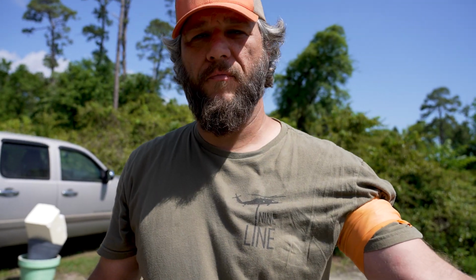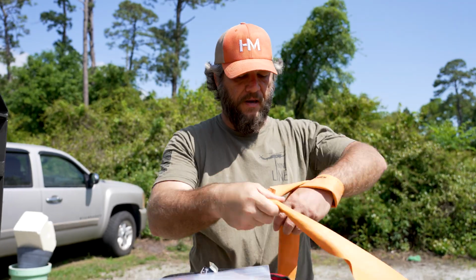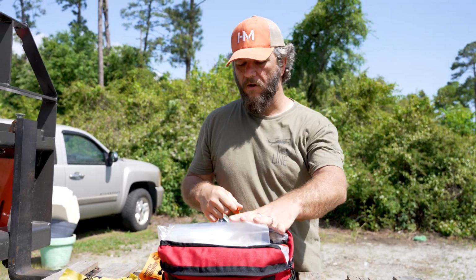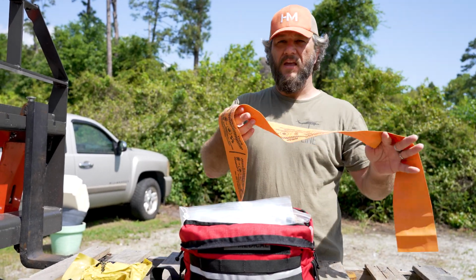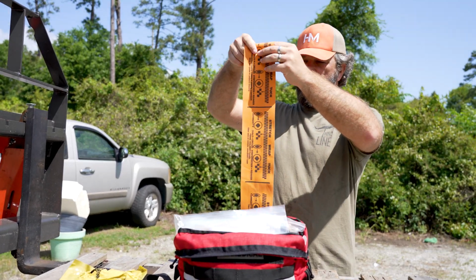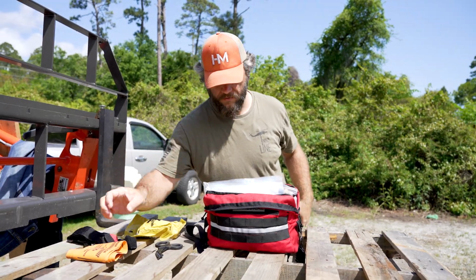Okay, so there is a way of doing that. And I have seen, on Bear Independent, the channel of the guy who owns Refuge Medical, one of the guys there was saying that he actually cuts these in half so that he has them for kids. So he's got 2 for kids. So there you have another tourniquet. Very easy to put on somebody else.